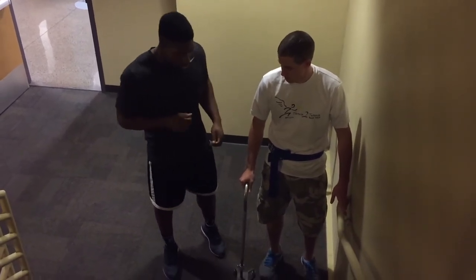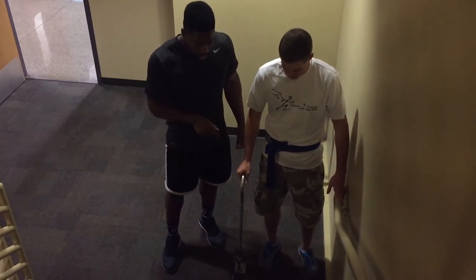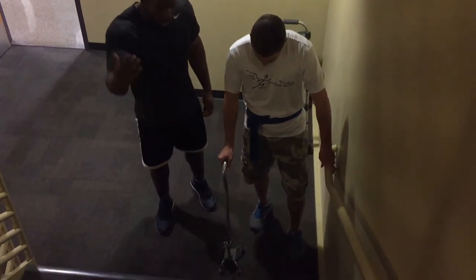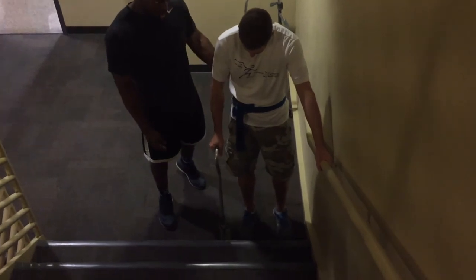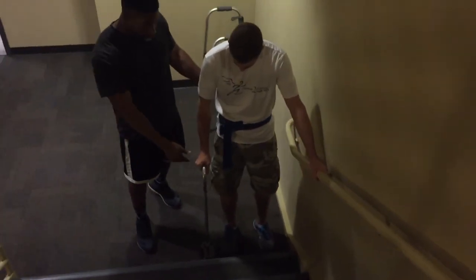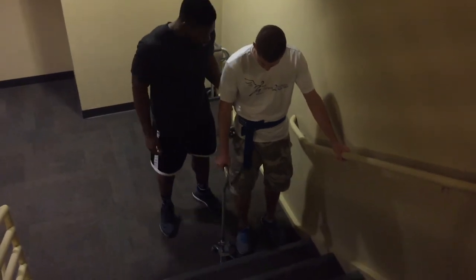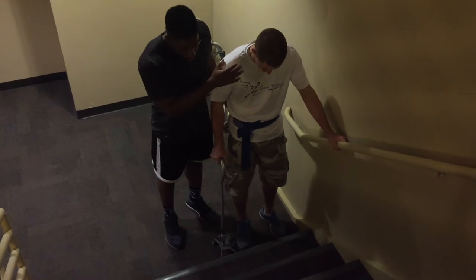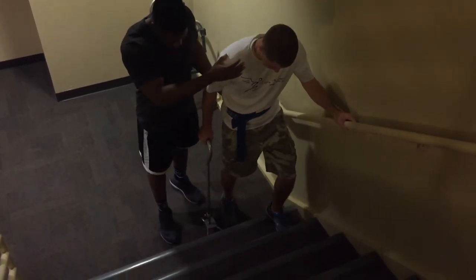Okay. So what you're going to do, you're going to step with your good leg first. Then you're going to push up off of the cane on that bad one. And then when you're coming down, we're going to do the weak, the bad one first, and then the cane, then the strong side. Okay. All right, so I'm going to hold you here at the gait belt and support you here. So you want to step with your good leg first, so that left leg. Then you go ahead and push up to the stairs.